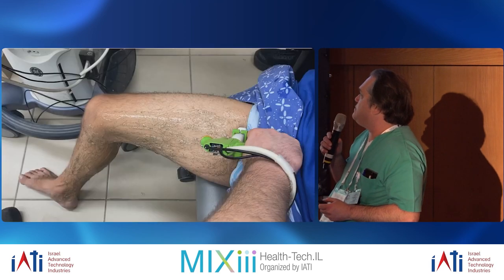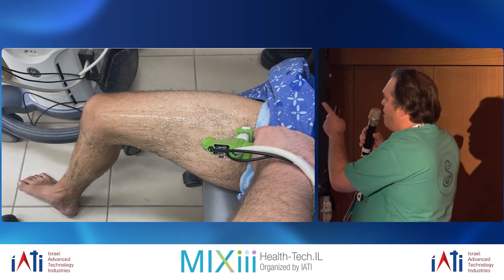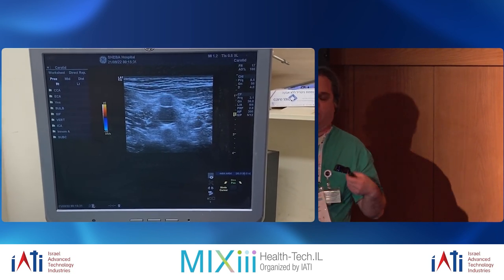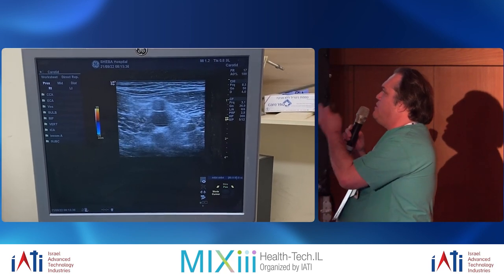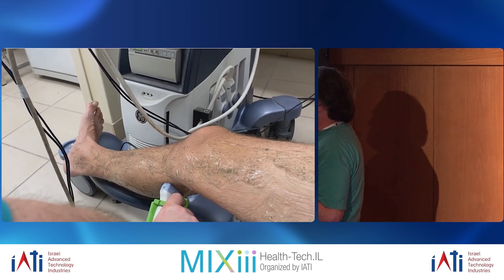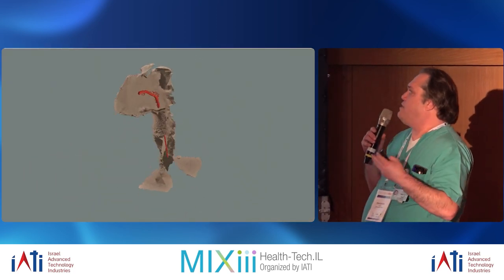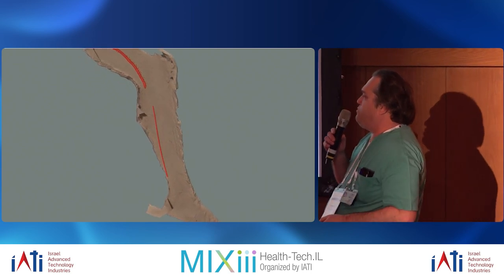The next experiment was Doron's leg. Still a handsome boy. What we wanted to see here is the superficial femoral artery in the leg, which always gets clotted when someone is diabetic and smoking. So this is a very important artery. We are scanning Doron's leg, and the computer is getting all the optic images and all the ultrasonic images synchronized, and we can have the superficial femoral artery in the thigh and the posterior tibial artery in the calf.